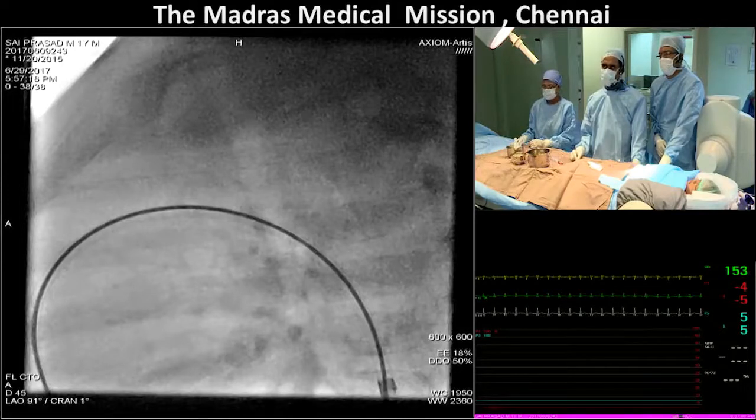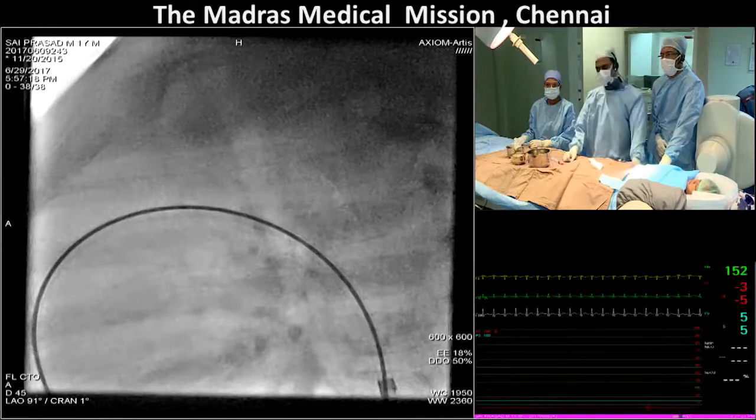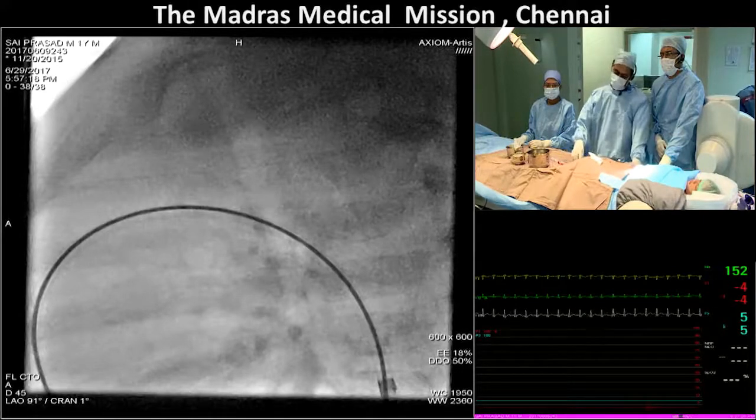Shiva, can I ask you a quick question? Yes. Do you ever come across spasm in the duct in this sort of approach? Because you're not using arterial access. You're crossing the PDA with a wire and catheter. Yes. And have you come across spasm as being a problem?